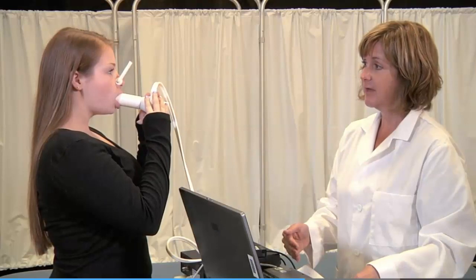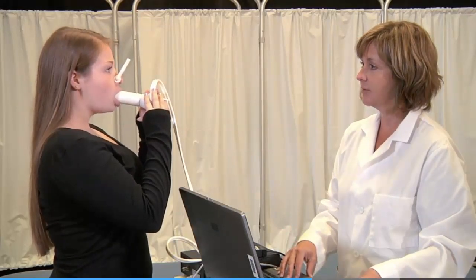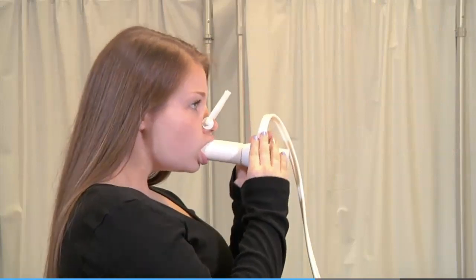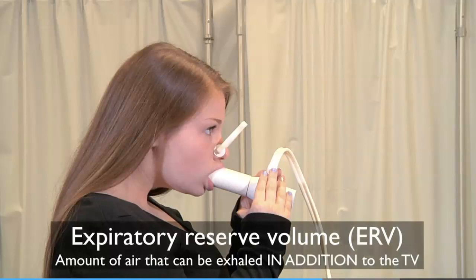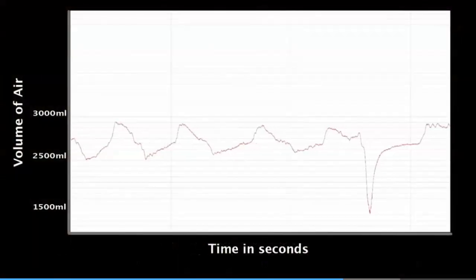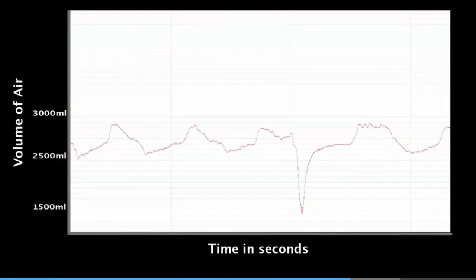To measure the additional volume of air that can be exhaled, inhale normally. Then, exhale as much air as you can into the spirometer. This additional volume of air beyond the tidal volume is called the Expiratory Reserve Volume, or the ERV, and is typically about 1,200 milliliters. To analyze the results, read the volume of air moved on the y-axis.